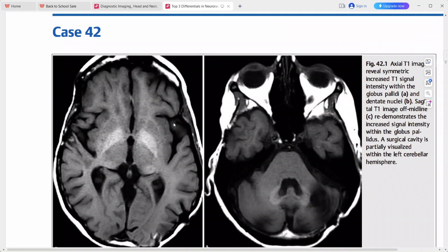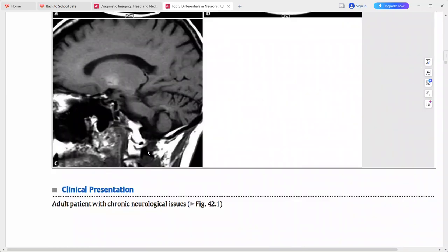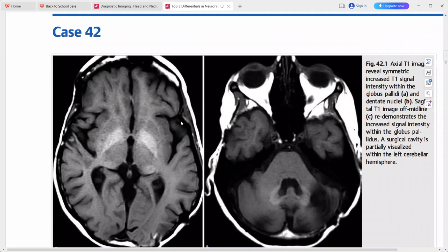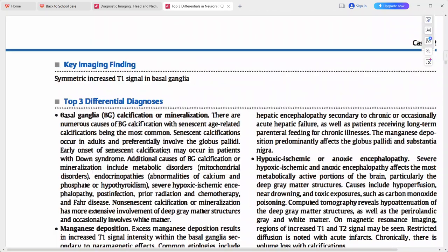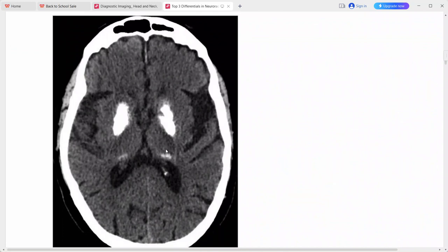The top diagnosis for symmetric T1 hyperintensity in the basal ganglia in this context is basal ganglia mineralization post-radiation therapy — the surgical cavity suggests prior tumor and radiation treatment. Differentials also include manganese deposition, hypoxic ischemic encephalopathy, neurodegenerative disorders like PKAN or Hallervorden-Spatz disease, neurofibromatosis type 1, or CADASIL.